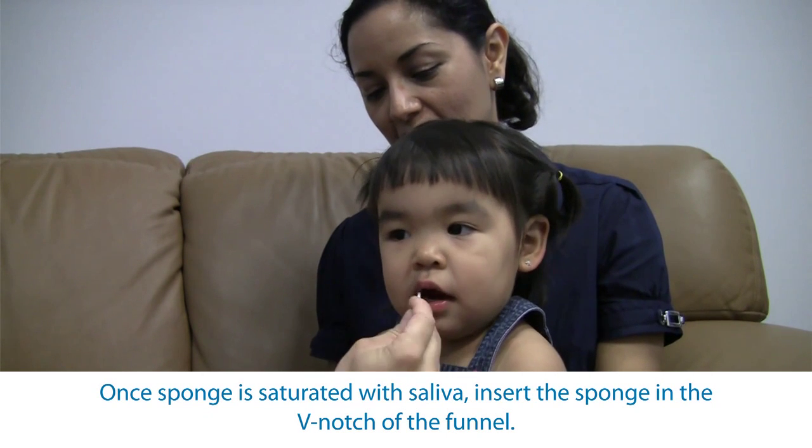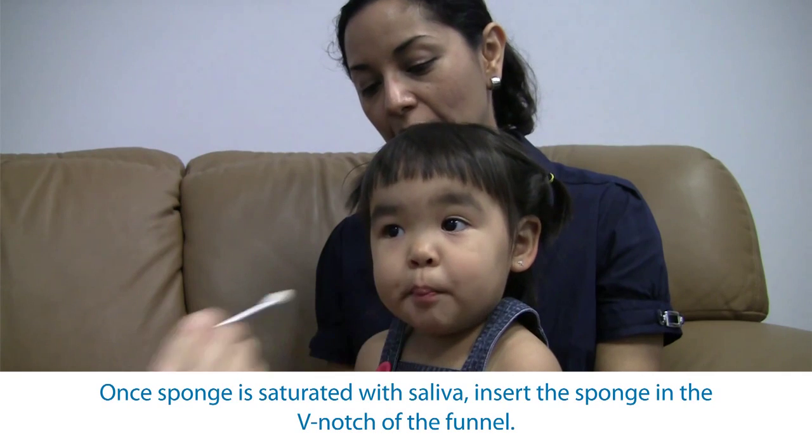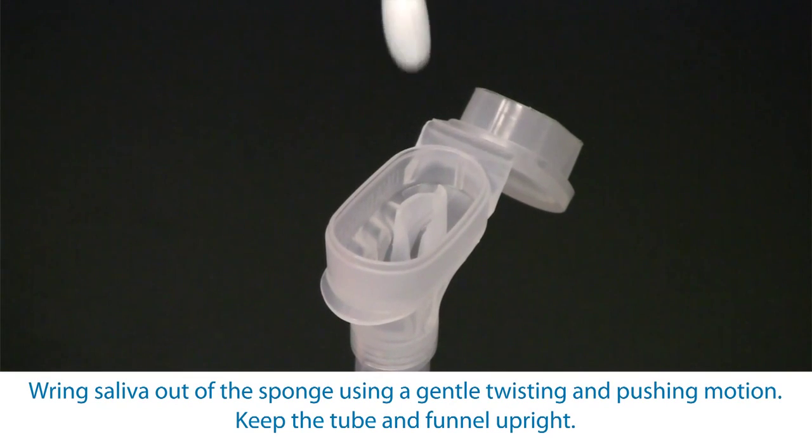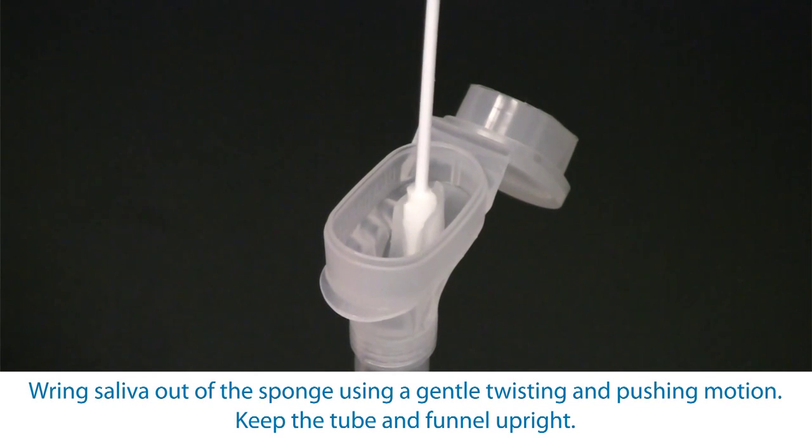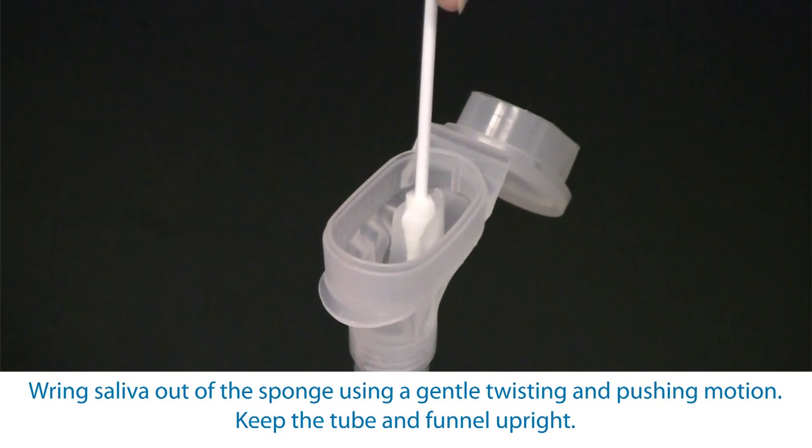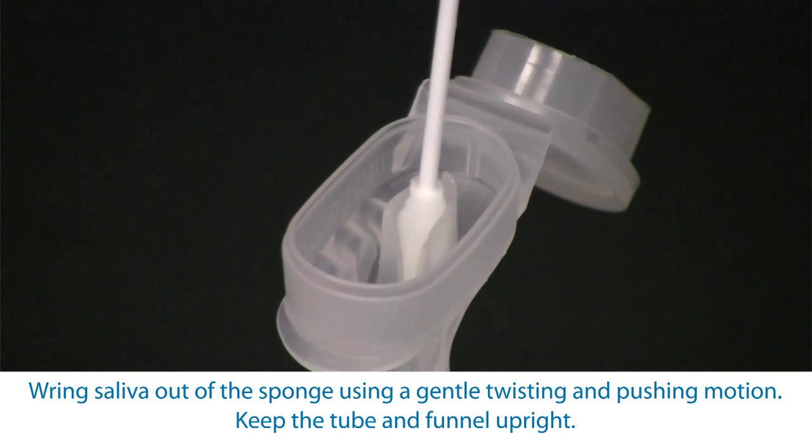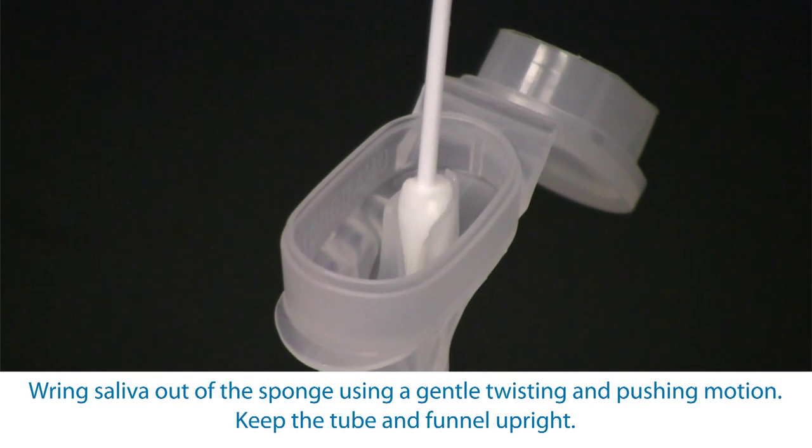Once the sponge is saturated with saliva, insert the sponge into the V-notch of the funnel. Wring saliva out of the sponge using a gentle twisting and pushing motion against the inner wall of the V-notch.